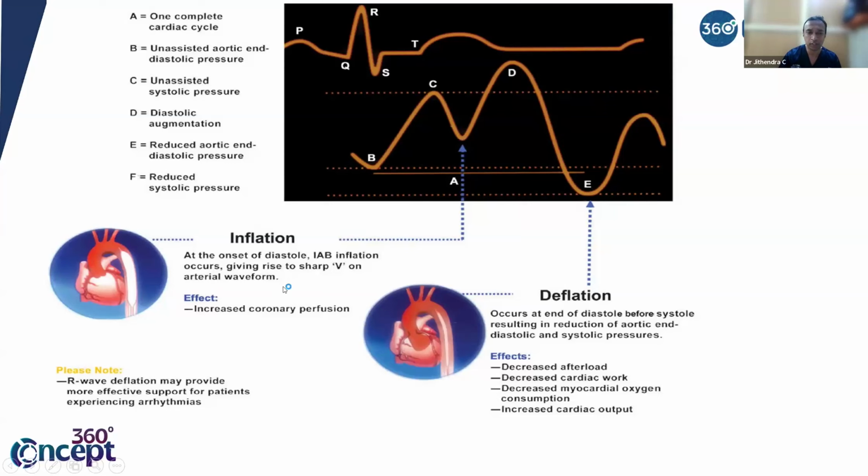So we'll read what the physiology is in the subsequent slides. This is just to show you the location of the inflation with respect to your ECG trace. Inflation happens at your T wave and deflation happens just before your R wave.